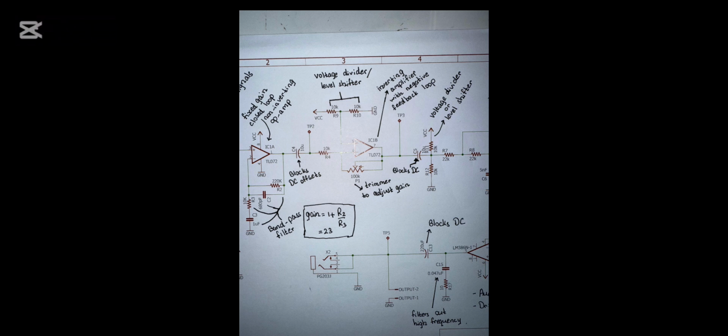P1, the 100 kilo ohm trimmer potentiometer, controls the feedback signal, and it can reduce the overall gain of the amplifier. R9 and R10, also found as the level shifter, provide the voltage and the virtual ground for the waveform as in stage 1. And this stage can be used to stabilize the waveform and adjust the intensity of the waveform.